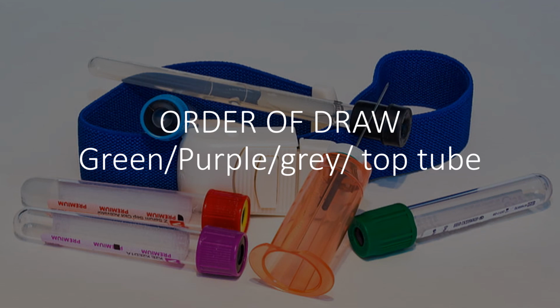Okay, our purple top tube also has an additive in it, which is EDTA, right? And EDTA is an anticoagulant, prevents the blood from clotting. It also helps with cell morphology. It helps maintain that cell morphology, so that when they're looking at those cells under the microscope, they'll be able to tell the difference in the cells. So that's another little added thing with that EDTA.